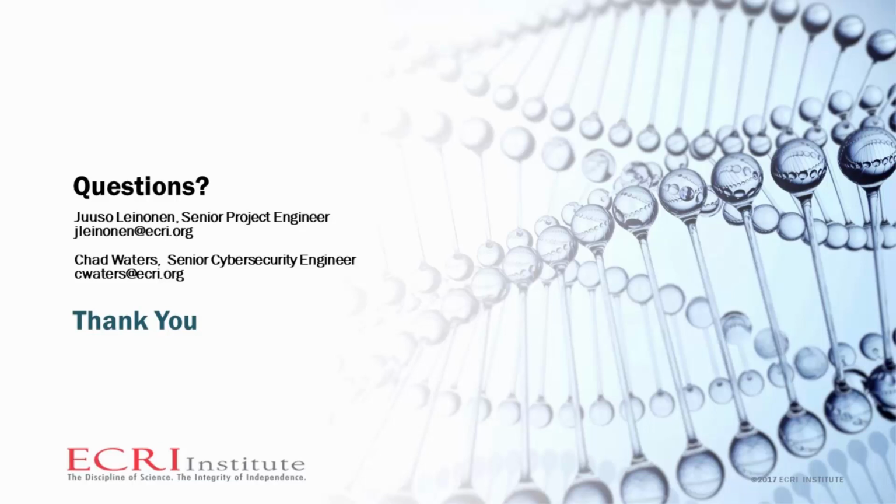So yeah, this is Chad. If you need to still use these particular devices, I would definitely recommend that you use compensating controls to isolate it from the network and make sure that the only thing they can talk to would be maybe the PACS systems to get the images, and make sure that there's no other access to them. If you still need to use them, it's fine. Just keep them very, very isolated.